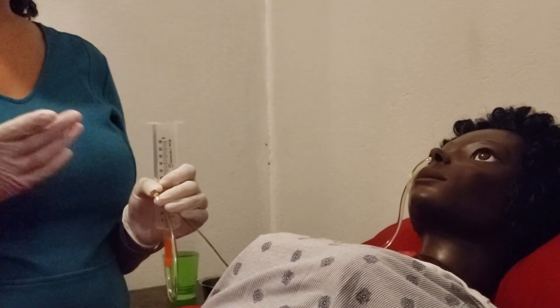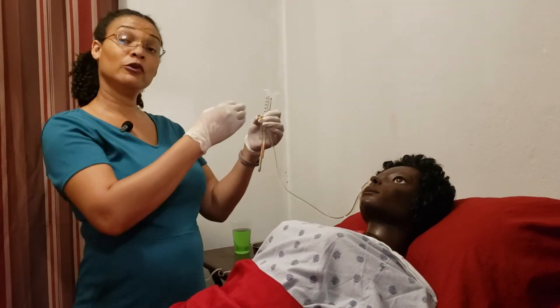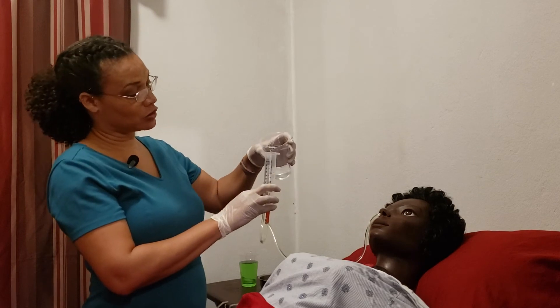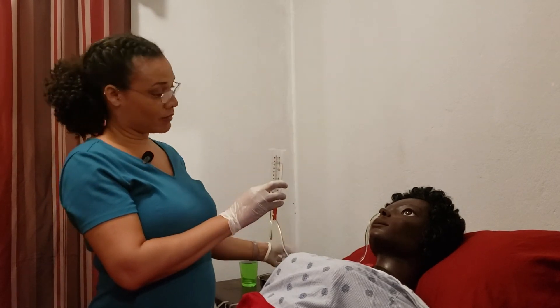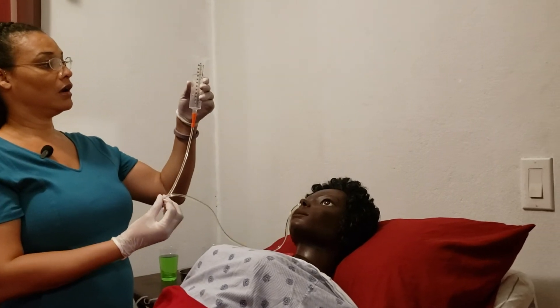When you're finished with your feed, run through about 50 to 100 ml of water to flush the tubing out. Normally feeds are a slight white or yellowish color — the green was just to show a difference. Note and record how much water you put through; in this case 55 cc's. Run the water through and stop before air has entered the system.